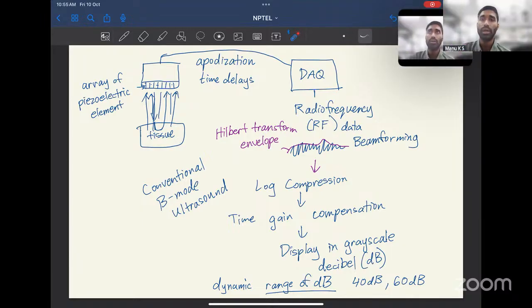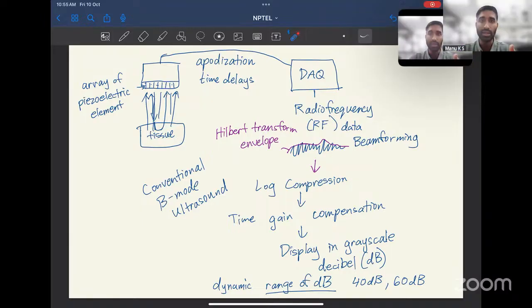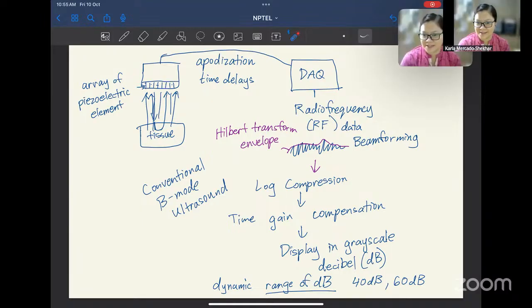I know that there are some temperature-based lenses whose properties change based on the temperature. You have heating pads behind, you change the temperature, which will change the aperture of the lens, with which you can control where you're focusing. But I don't think those are being used in commercial systems. Yeah, many of those are still in the research stages.